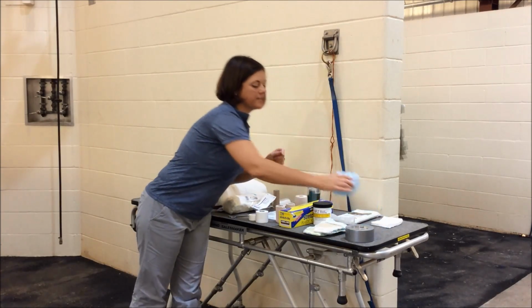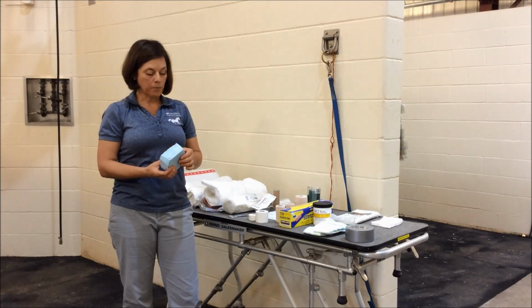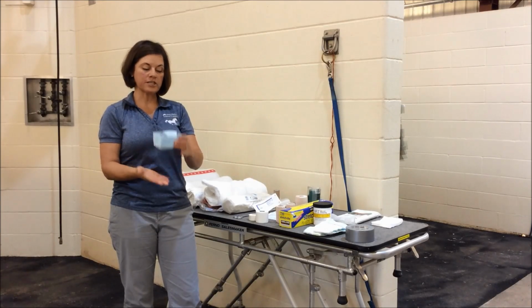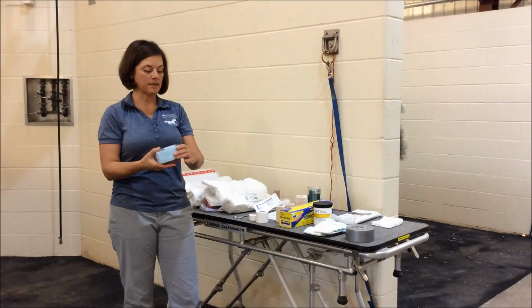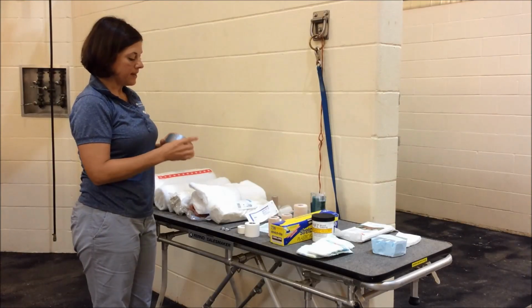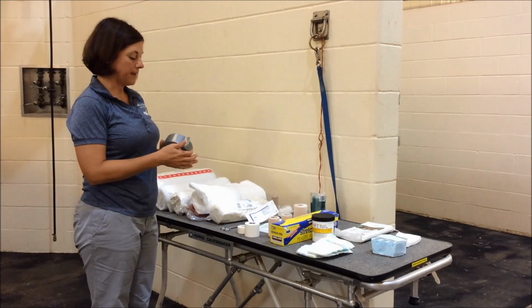This is just a piece of styrofoam insulation that you can get at your local hardware store. And we use foam insulation to make foot pads. And then we can just apply that to the foot directly when we've got a horse that has very sore feet, usually from laminitis.